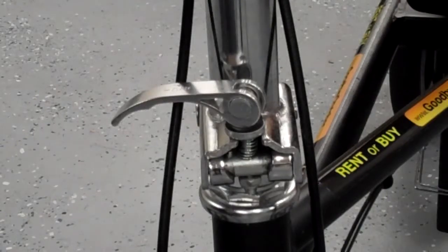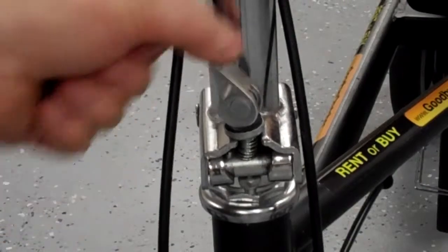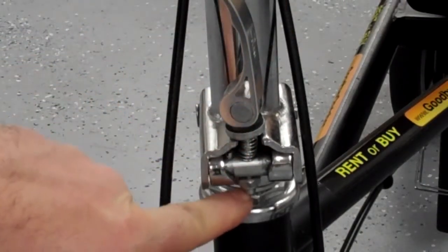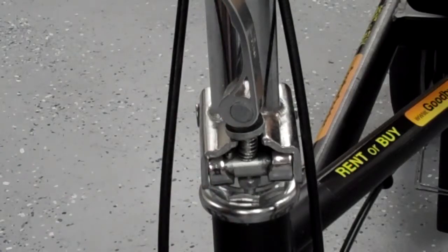With time, you might find that the mast clamp either tightens up or loosens up on your Pathfinder turning leg caddy. It's a very easy adjustment. So if it's too loose, what you need to do is tighten it down here, and there's a nut on the bottom that needs to be captured so it doesn't keep turning around.